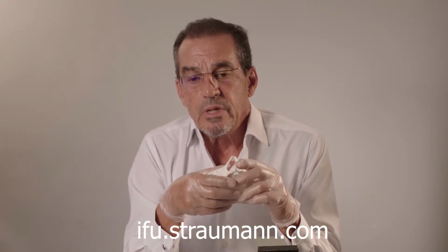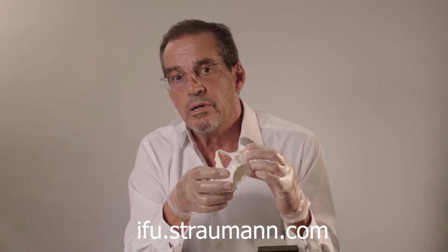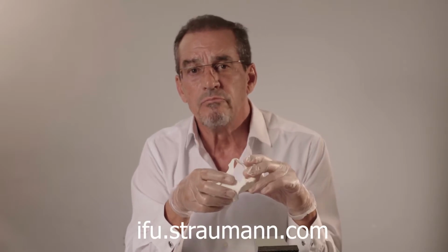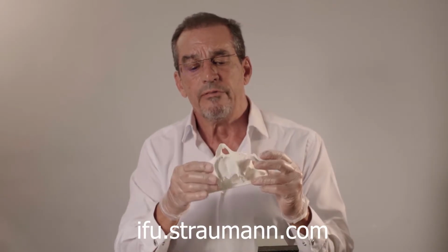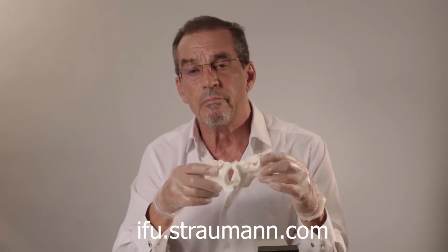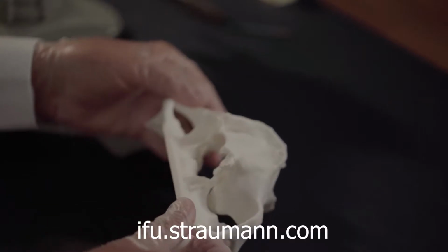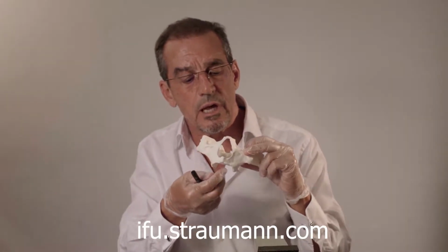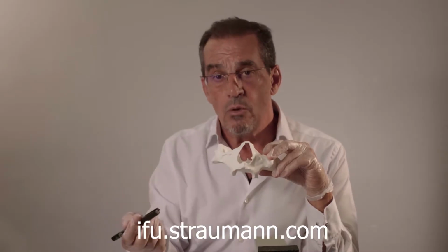First of all, I would like to introduce you the model we are using for this hands-on practice. This is a model of an extremely resorbed maxilla. This is the patient profile. The anatomy is more pronounced on this side, whereas on the left side it is more flat.